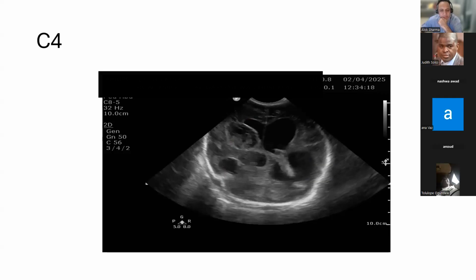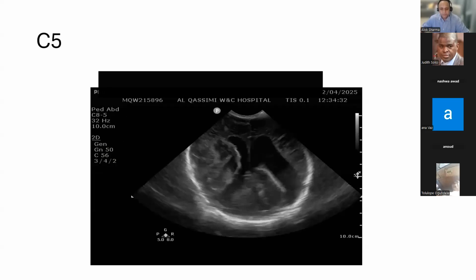Then I went back, but it's showing more dilation of the ventricle, and at the same time the hematoma. And then I went back, this is, I think, the body of the ventricle, and it's almost the same. It's quite a large grade 4 actually, and it extends into the area of the trigone quite significantly into the hemisphere. So yeah, it is a little bit worrying. Carry on. Image quality is very good.